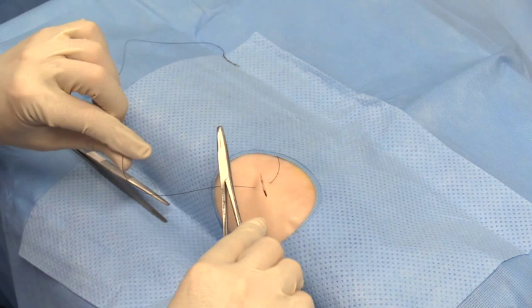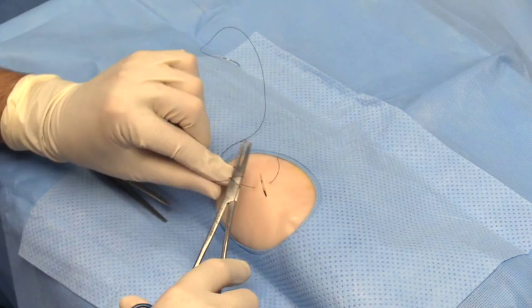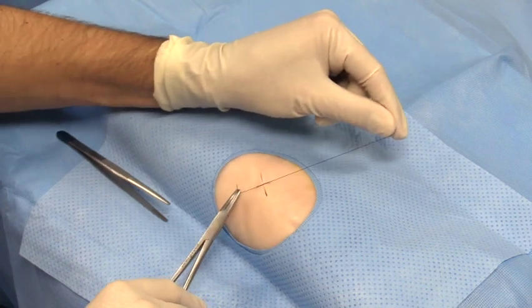Place your needle holders between the suture and the wound. Wind the suture over the needle holders, making 2 complete revolutions. Now grab the short end and pull it through the loops that you've made. Pull the suture firmly but not super tight. The long end and the short end should now have changed sides.